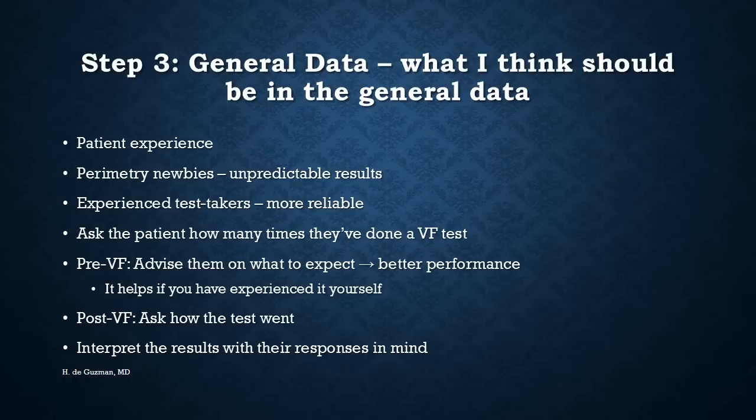For example, if the patient says, "Yeah, during that last perimetry, I was getting a little sleepy, my eyes were drying up." So you now will understand why maybe there's more artifacts this time, or why the results are not so reliable this time.